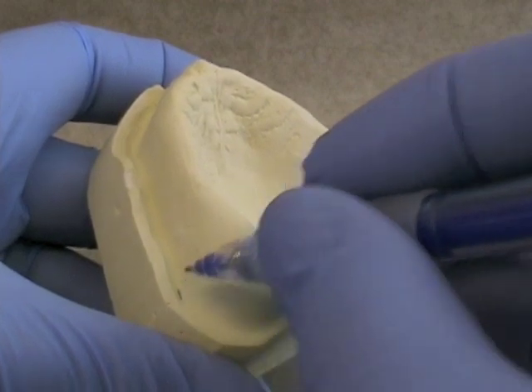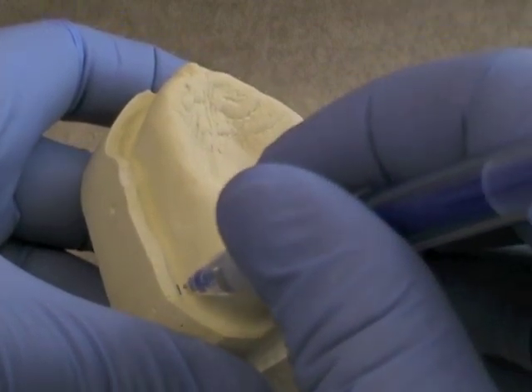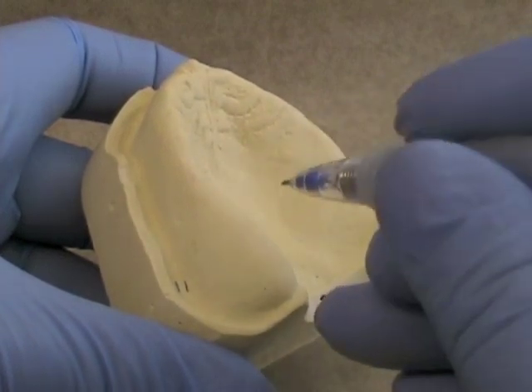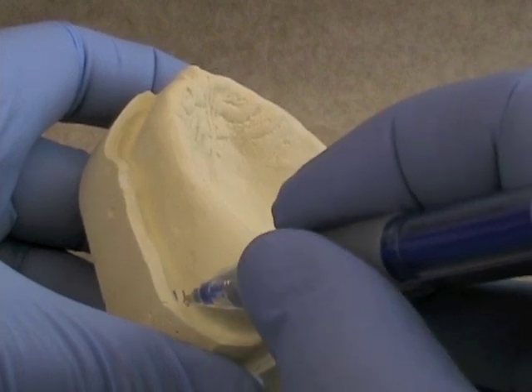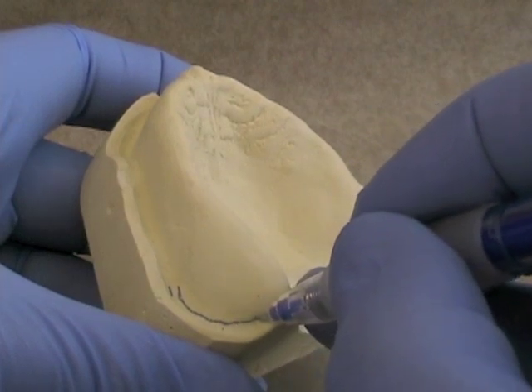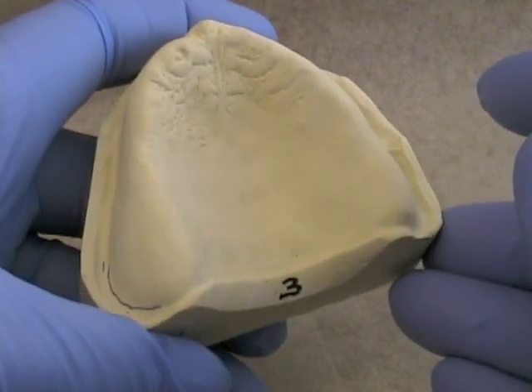So if you look over here, we've got a horizontal portion that represents the vestibule. We want the tray to end on the vertical portion of the ridge and to be a couple of millimeters above that. So we're going to draw our line in the vestibule a couple of millimeters short to allow for room for the compound. The exception is on the posterior border.